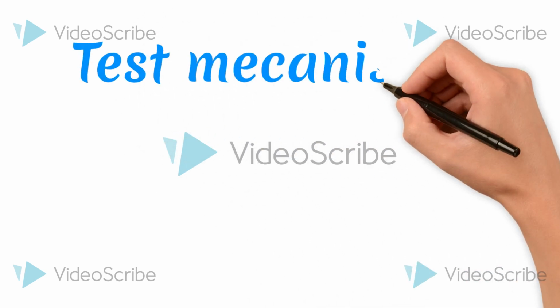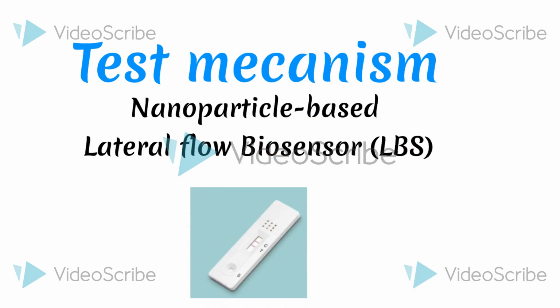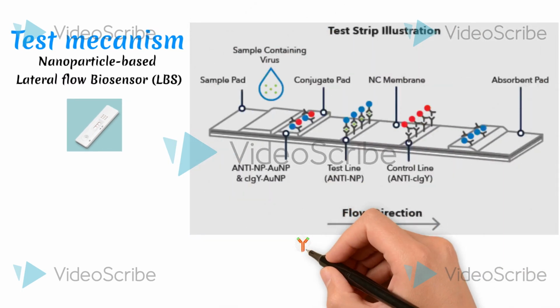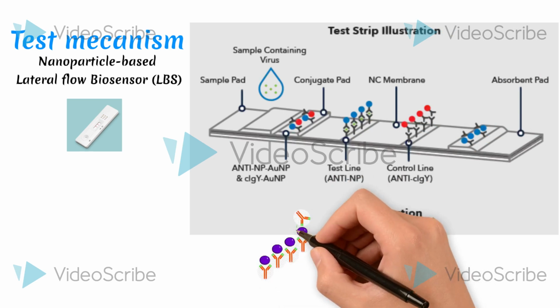A standard lateral flow strip (LFS) consists of 4 main sections: a sample pad made of cellulose; a conjugate pad made of glass fiber impregnated with a label particle and a receptor for the analyte; a detection pad, a nitrocellulose sheet where the test line (TL) and control line (CL) are printed; and an absorption pad, also made of cellulose.